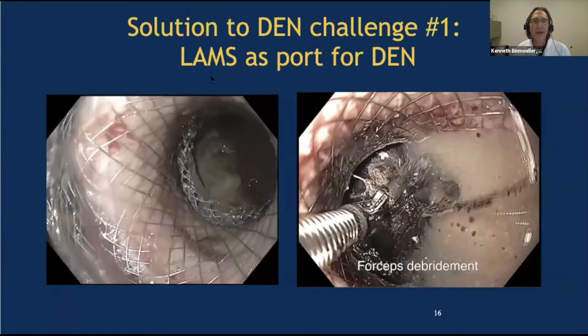You may have adherence of the WON to the gastric wall, for example, so you don't need it in the same manner that you'd want it for gallbladder drainage, which is not adherent. The lumen-apposition here is the stability of the stent so that you can go in and out of the cavity without dislodging the stent each time. We've had SEMS for some time, but you couldn't do necrosectomy through a conventional tubular SEMS.